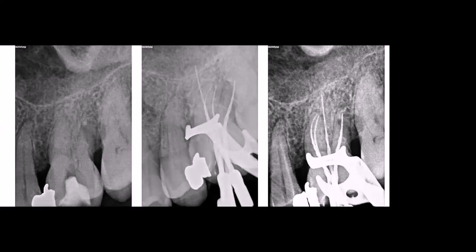We have to keep in mind that rotary path files are very useful to do the glide path, but the diameter at the tip of the file is small, and as we know, the resistance to torsional fracture is related to the mass. If we have a big size, we will have a high resistance.